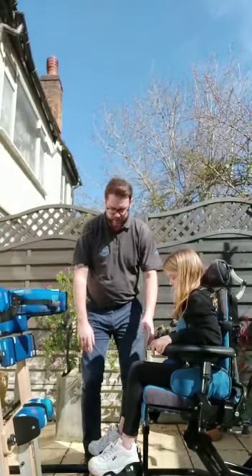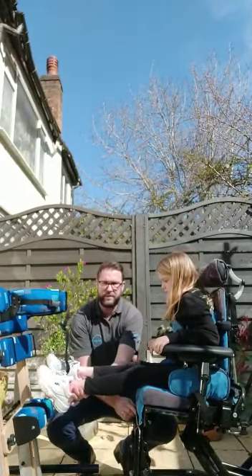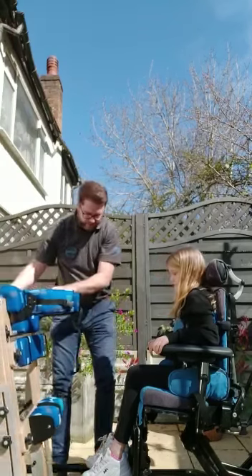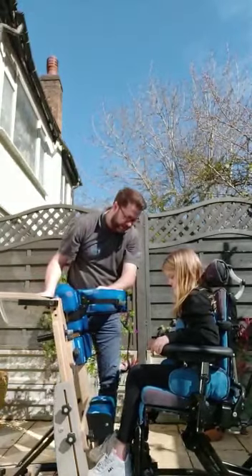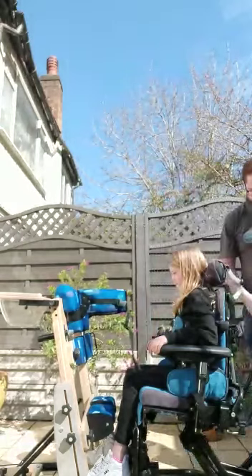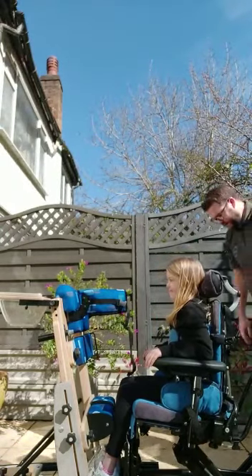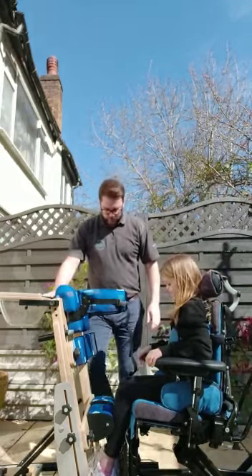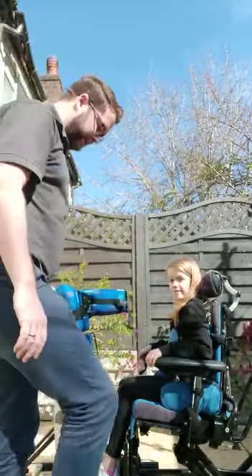If your son or daughter has a foot plate, help lift up their legs and flip that foot plate out of the way. Bring the standing frame in as close as you can so you can place the feet into the sandals, and then bring Bella down. Also make sure you've got all your brakes on on each side of the standing frame and the chair.